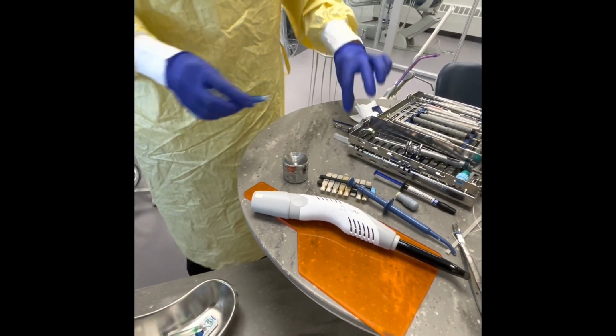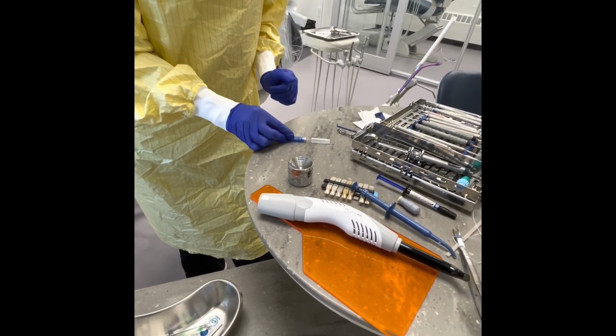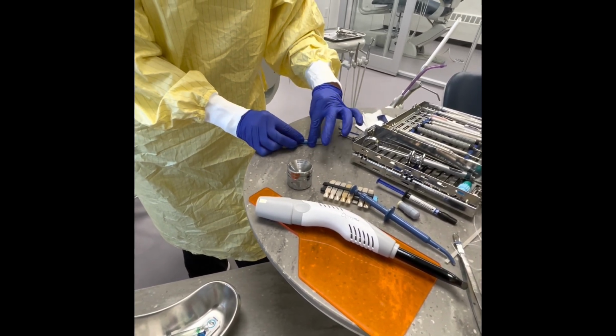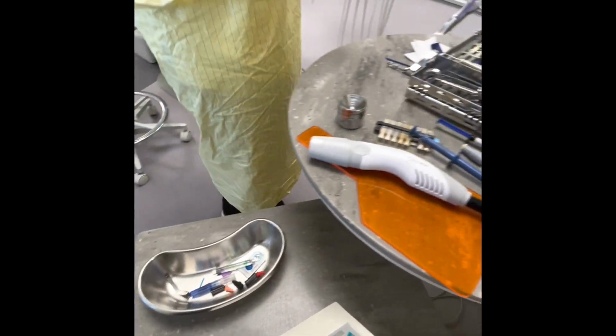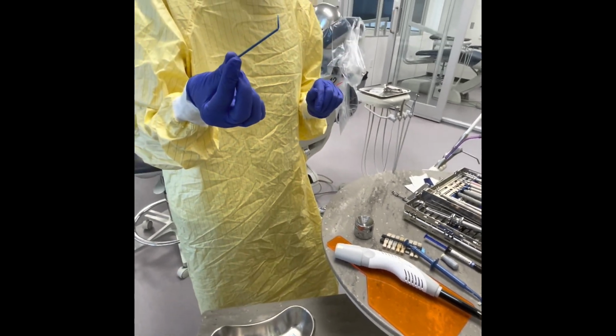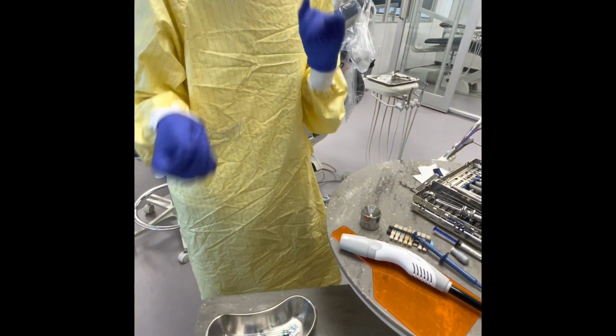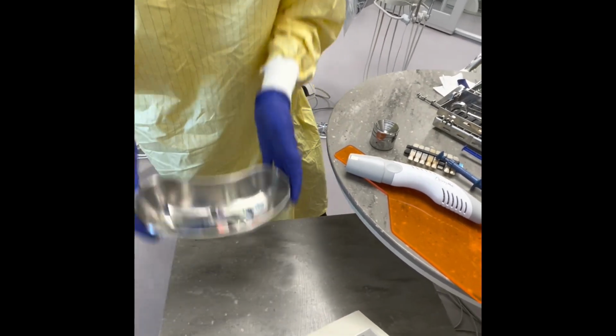Okay, gonna line up my cap. Make sure my hand isn't in front of there. Slide that in, put the cap back on, put it in my kidney basin. Okay, one thing I forgot to put in there was just my applicator. Okay, that has chemical on it, so it will have to go into that kidney basin as well.